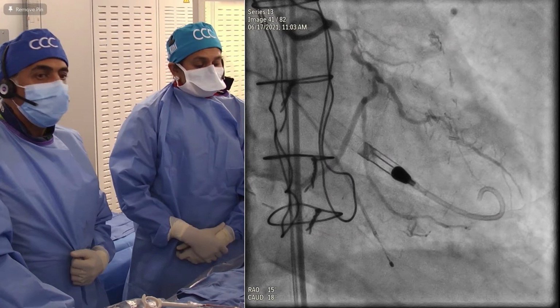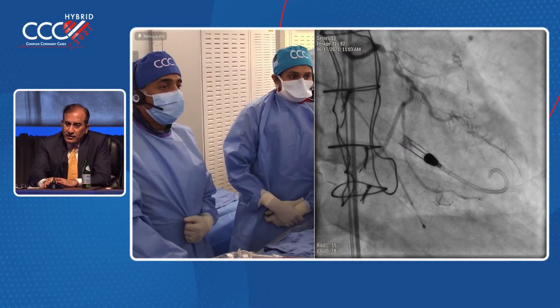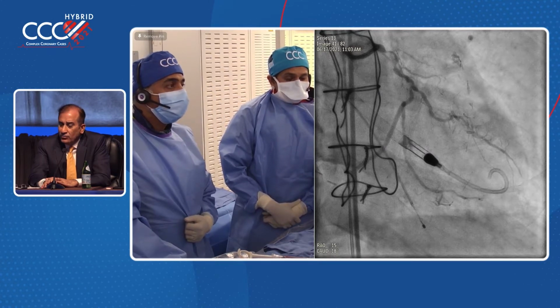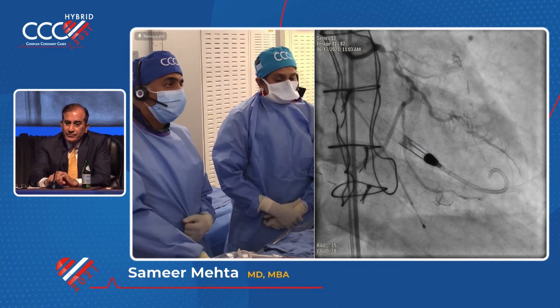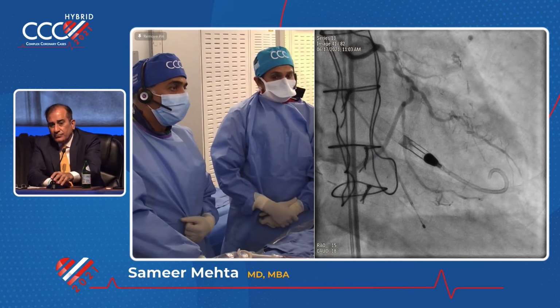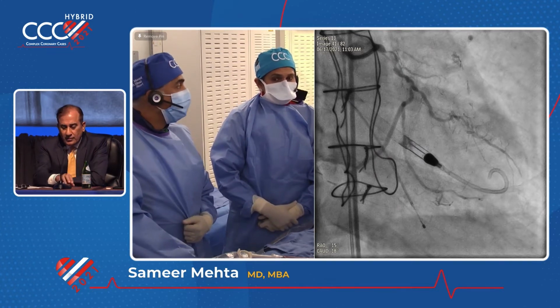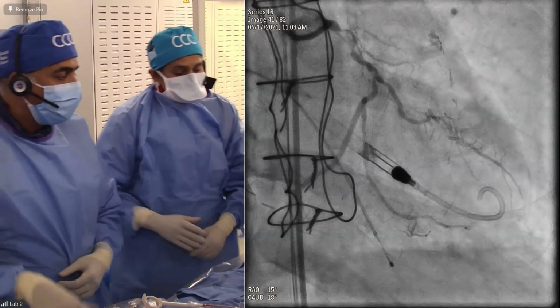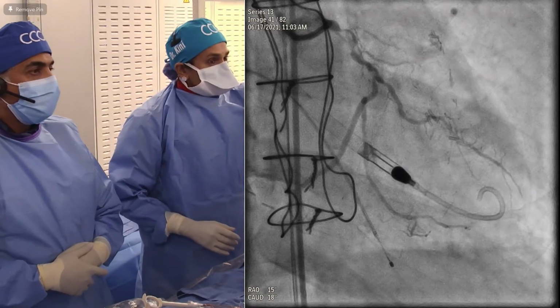Can you speak into the mic because we can't hear you? Probably a run-through wire, then exchange it for a rotor wire, probably starting with the 1.5 burr and expanding, I think, with the second burr. Wow, I get scared with a 1.5 burr. I don't know. What do you all think? Like 1.25, 1.5? I don't know. It's very, very severe. But I think wiring is very challenging in this case. That is, I think, the key in this.